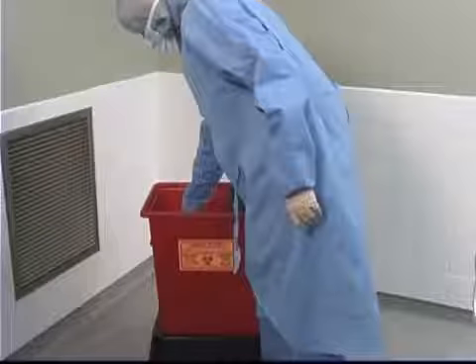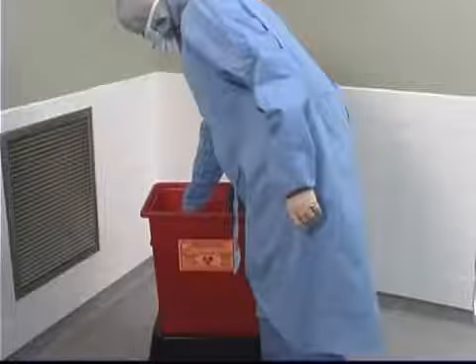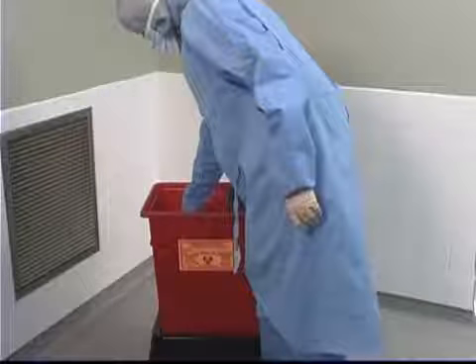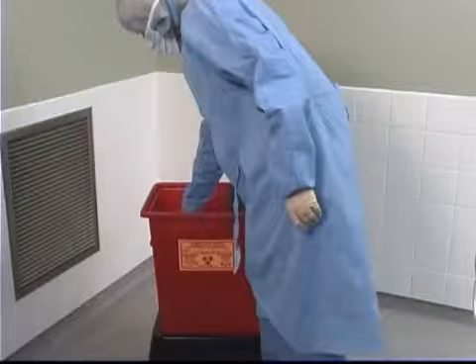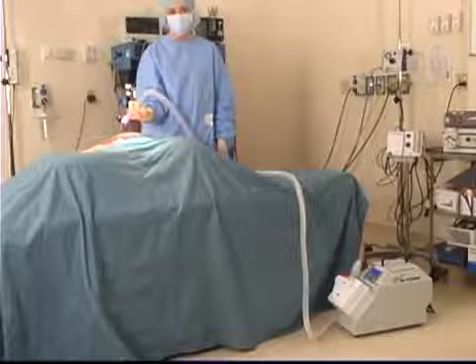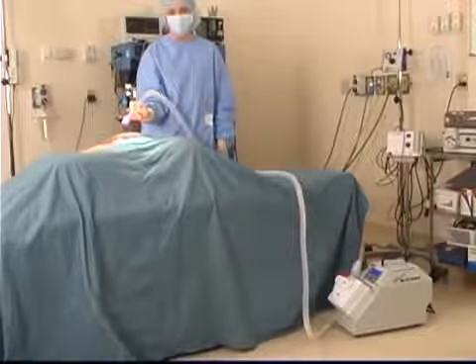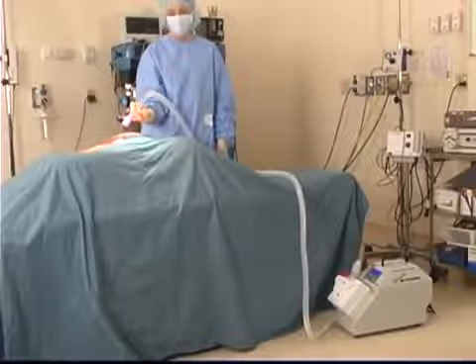It is important to note that smoke evacuation tubing should be considered biohazardous at the end of the case, similar to an expired filter, and should be disposed of in accordance to facility protocol for dealing with such contaminated items. Using a common 7/8 inch or 22 millimeter tube, you can position the distal end, or opposite end from that inserted into the filter, in a number of ways.